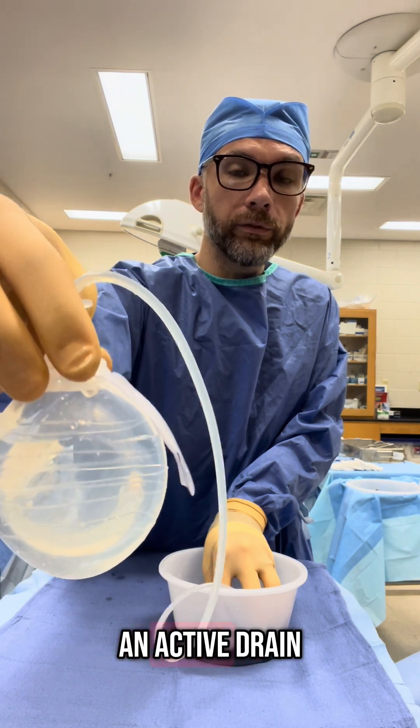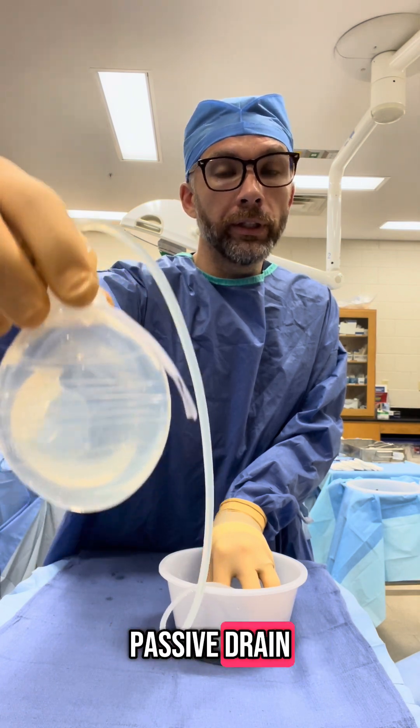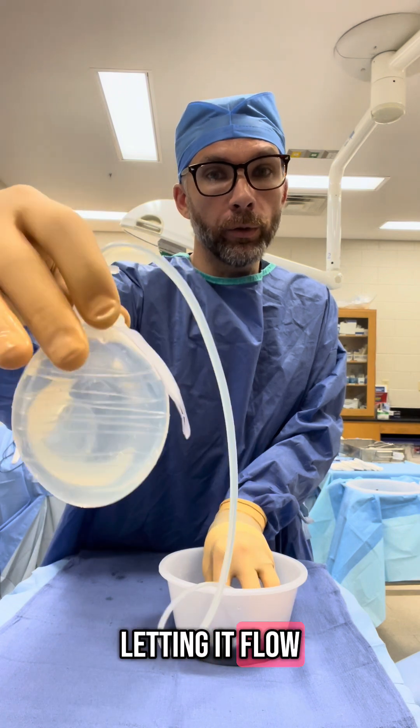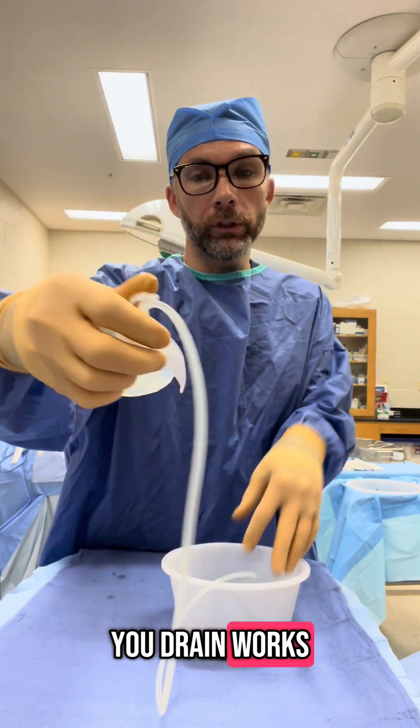So this is an active drain because it's acting as suction, where a passive drain is just passively letting it flow out on its own accord. So as you can see, this is how your drain works.